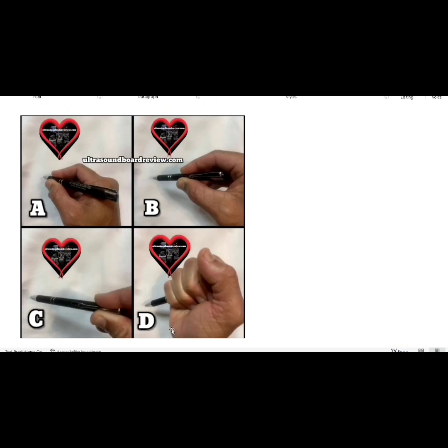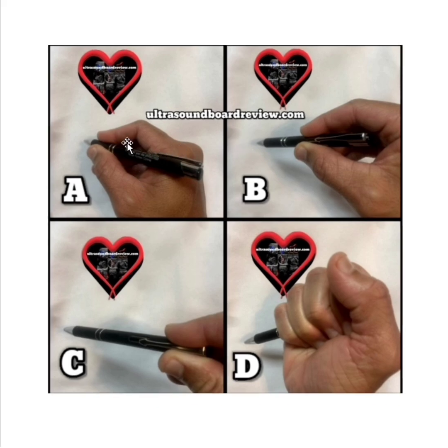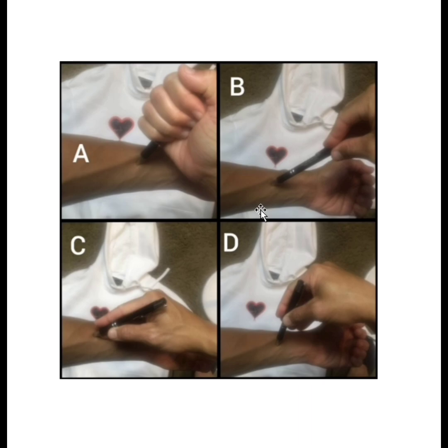Tell me which one looks like the correct way to hold the transducer. Image A represents the correct way to hold the transducer because it looks like the fingers are holding it in a way that's not too tight but firmly enough to maintain stability and control of the transducer. The fingers are holding it closer to the base and the patient rather than further away. Which is the correct way to hold a transducer in this image? The answer would be C, for the same reasons as before.